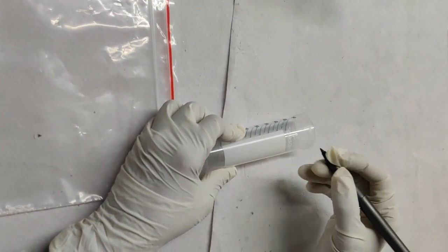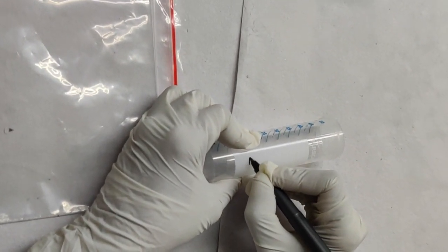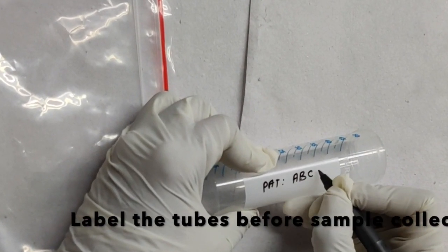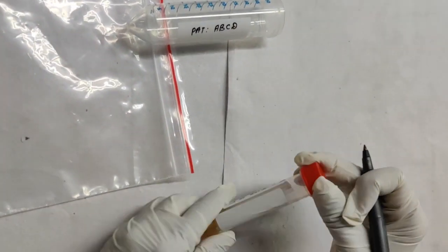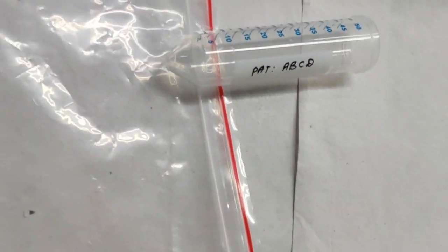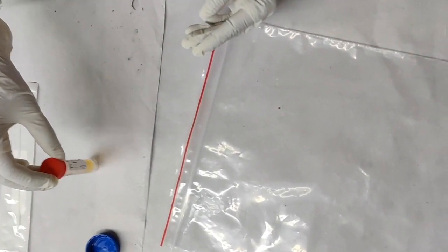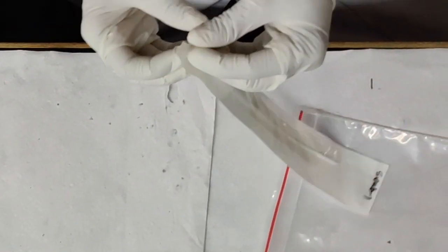Before you start taking samples, please label the centrifuge tube properly with patient name and demographic details. So, how you proceed is that you open the swab like this.